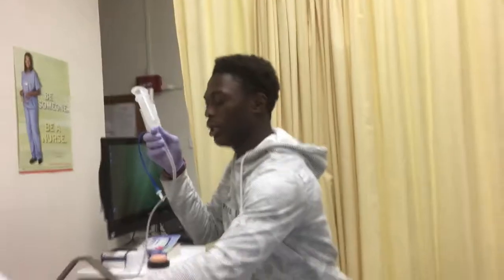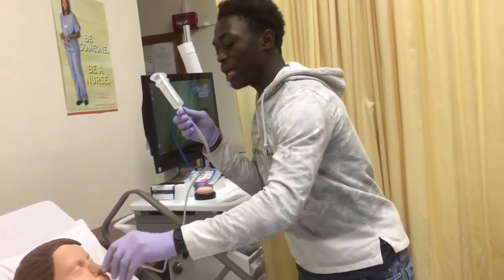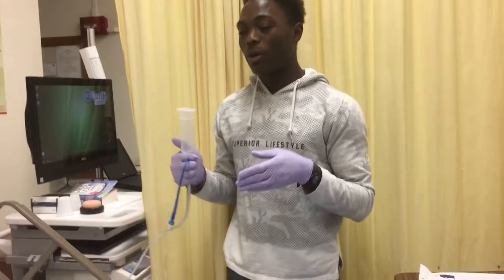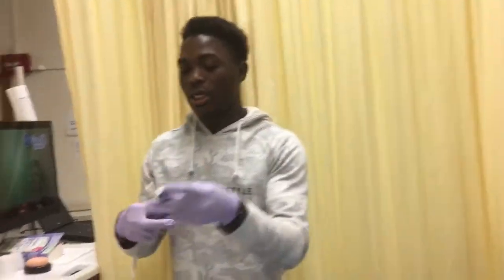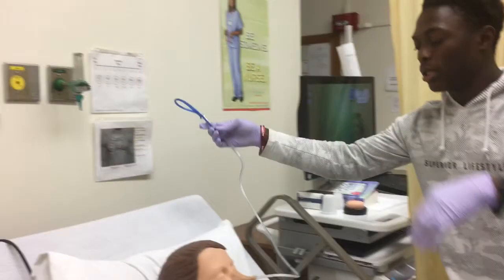So this is it. In a situation where the patient is on a continuous feeding diet, a continuous feeding is like an IV feeding, but it goes in the stomach instead of the IV. Okay, so after you're done with that, you can clamp your tube back and put it over you.